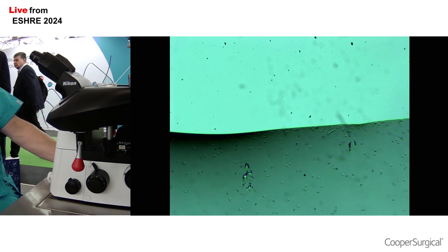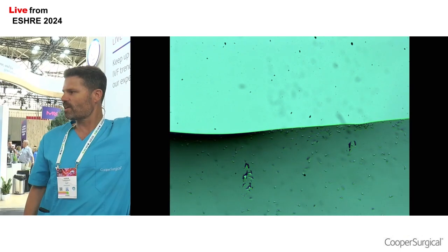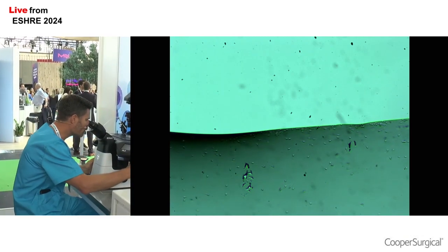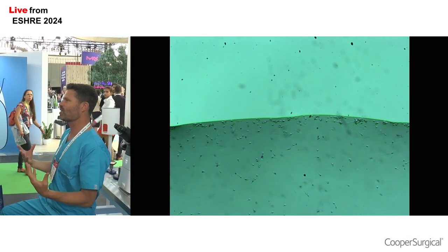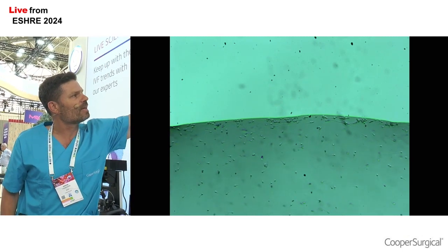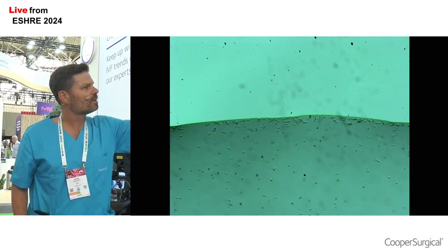Can you see a difference now how there's still motile sperm, but they're starting to find it more difficult to penetrate through. If we go further over, you can see it's a higher concentration of SpermSlow here. So more and more, these sperm are really starting to find it difficult to penetrate through the SpermSlow.